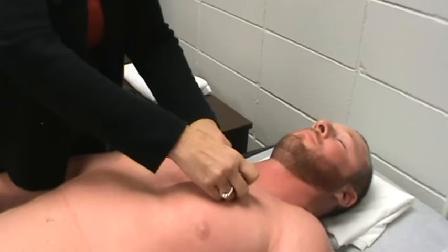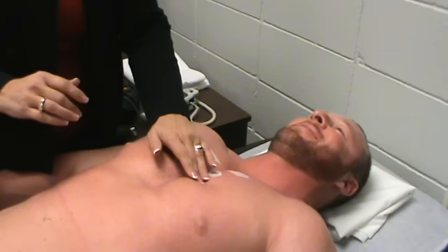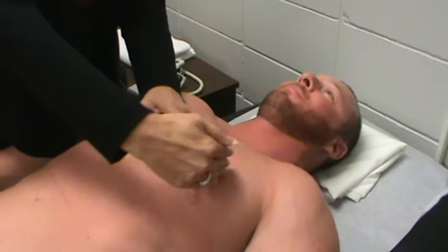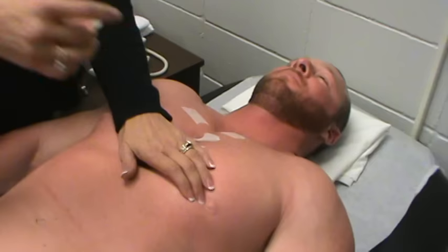Ooh, you're going to be mad at me if I rip off that hair, aren't you? Fourth intercostal space on the left sternal border is your tricuspid. And then midclavicular line at that fifth intercostal space is actually your mitral.